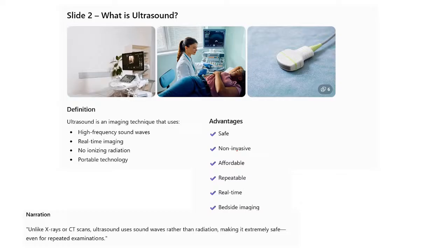By definition, ultrasound is an imaging technique that uses high-frequency sound waves, real-time imaging, no ionizing radiation, and portable technology. So the advantages of ultrasound are it is safe, it's non-invasive, it's affordable to most, it's repeatable, it's real time, and then we can have what is called bedside imaging. So the narration: unlike X-rays or CT scans, ultrasound uses sound waves rather than radiation, making it extremely safe even for repeated examinations.